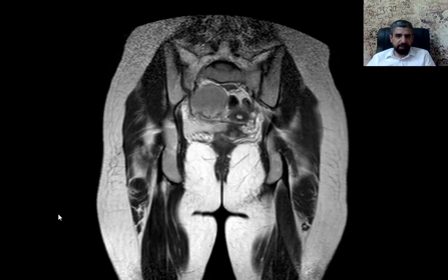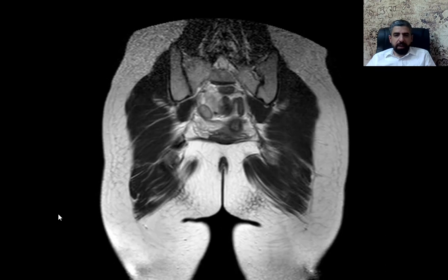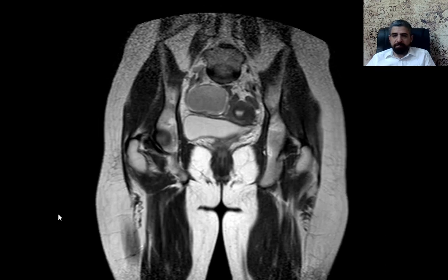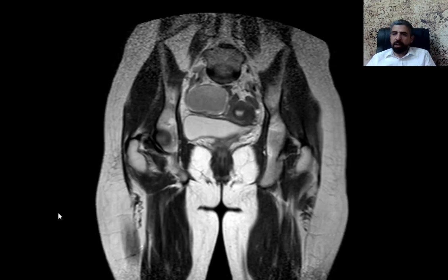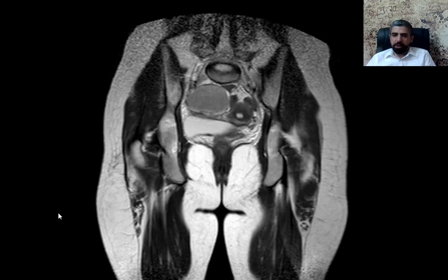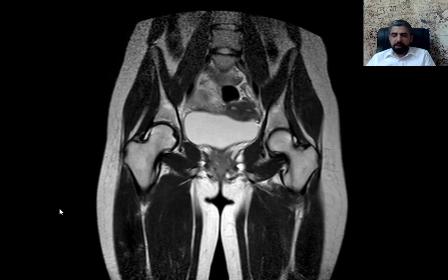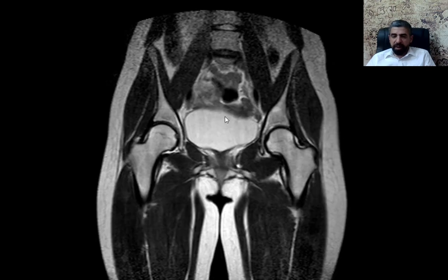There was a mass in the pelvis on the ultrasound, and an MRI was requested to further characterize the mass — its type, location, and relation to the adjacent structures. First of all, you can see this is a coronal image of a T2-weighted pelvis MRI.